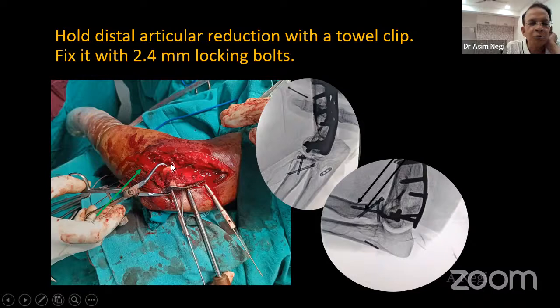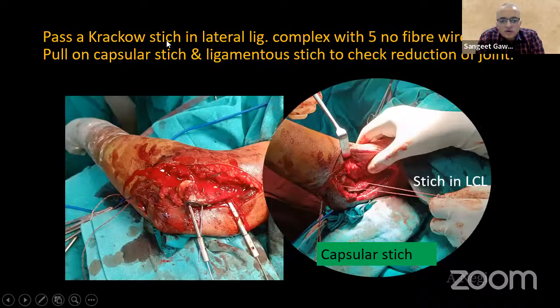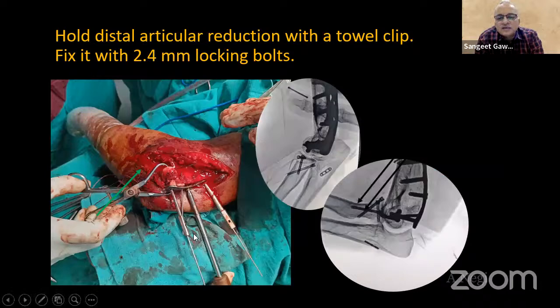Fix it with 2.4 millimeter locking bolts, multiple bolts there, and capsular stitch is the last thing. Use the suture disc, that is, go back to the slide, one slide back. For capsular, one ahead. So yeah, you can see here the suture disc. If you don't want to tie a knot, you can use a suture disc. This is for capsular repair.